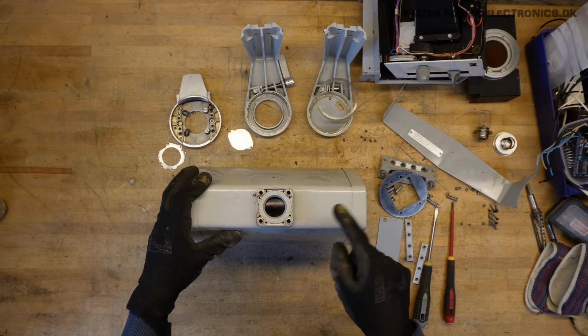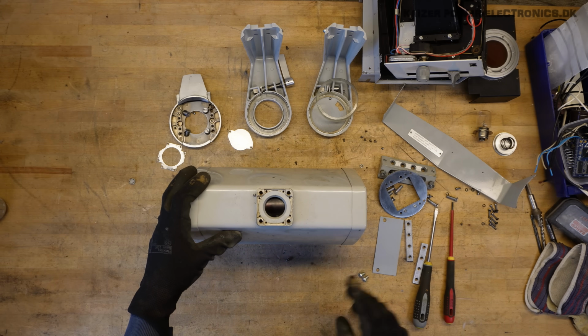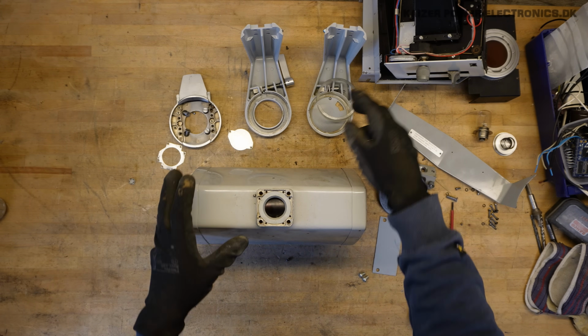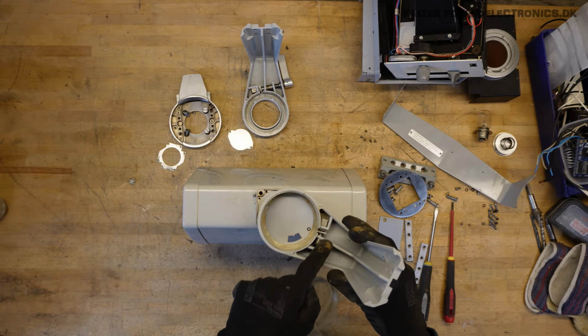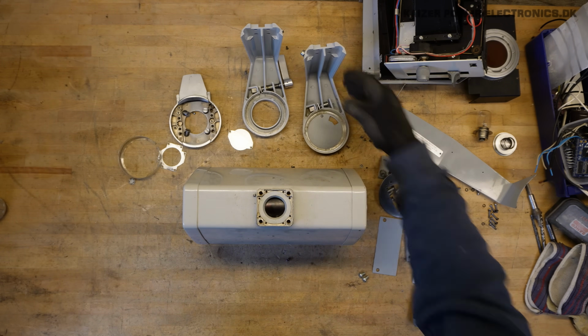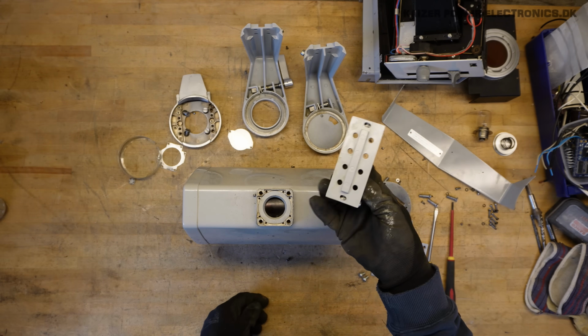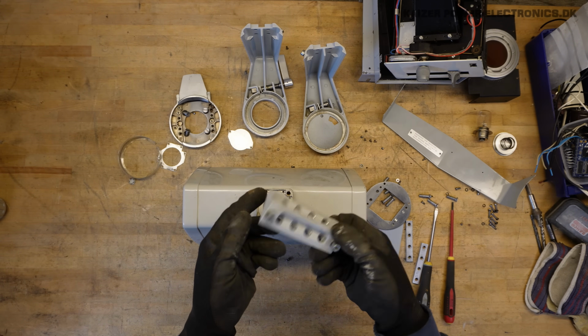We are now gazing down into the window of the X-ray tube itself. The collimator is taken apart. The whole arm assembly here is quite clever, again just sitting with a simple tightening band. It comes in two parts, and the same bracket that is used to mount this to the arm is also the one holding it together.